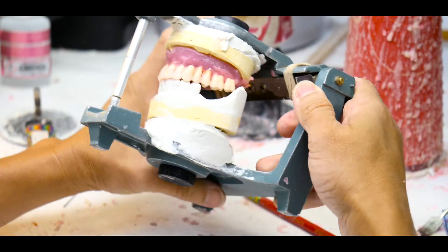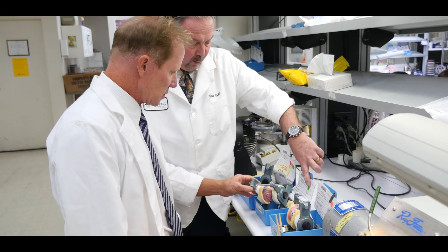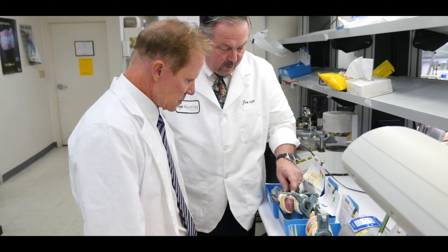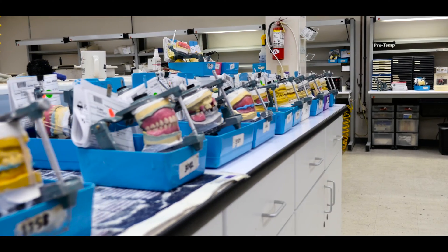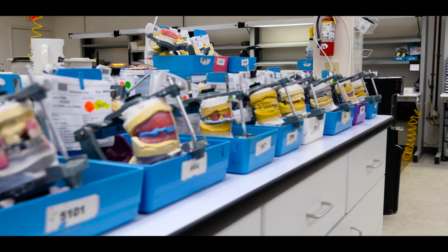The finish and the fit are outstanding. The teeth we utilize are the Phonaris brand, which is Ivoclar — it's a composite tooth, beautiful and durable. That includes the bite block, so it's kind of a kit — all these different dentures are all-inclusive: your bite block, your try-in, a setup, and then the finish.